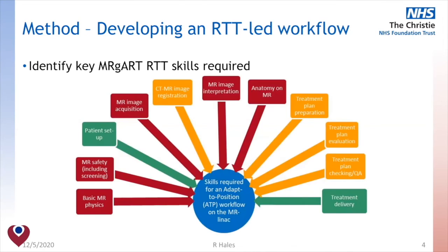So in terms of methods, the first step was to identify the skills required by the therapeutic radiographers to lead these treatments on the MR-Linac. And these skills here are those required for an adaptive position fraction.